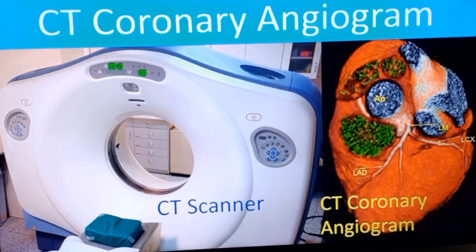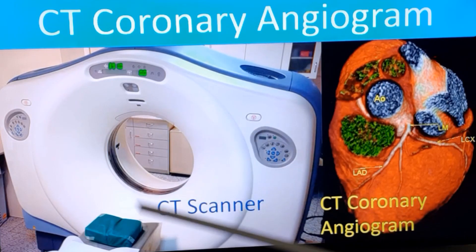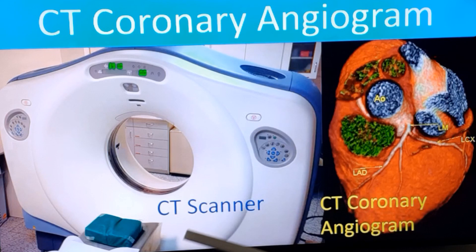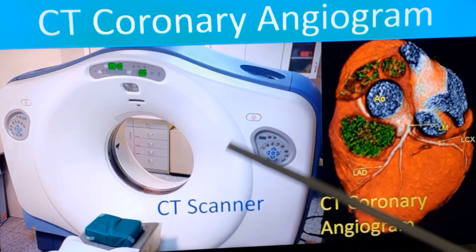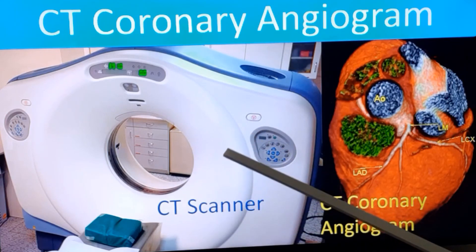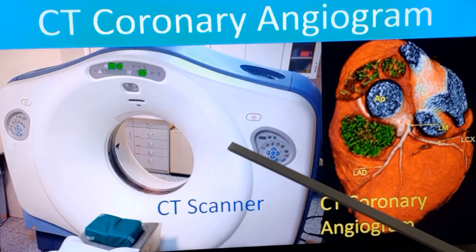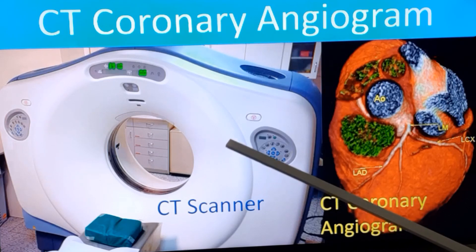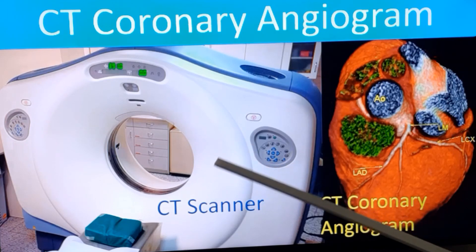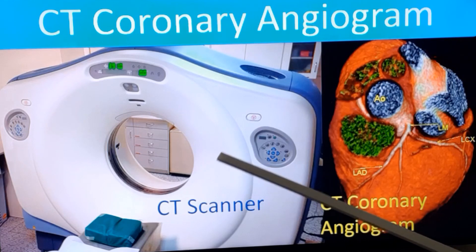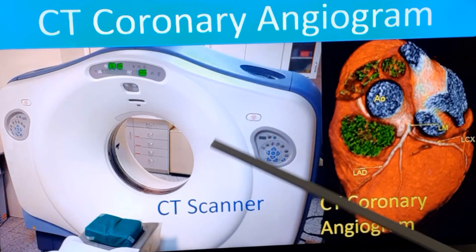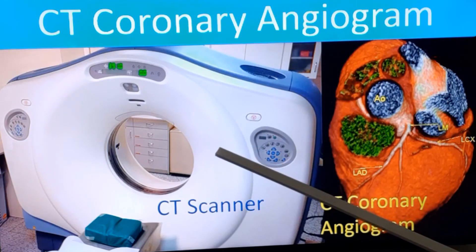Now we will see what a CT coronary angiogram is. CT coronary angiogram is an outpatient procedure done in the CT console. You can see the CT scanner here. The only difference from a usual CT scanner is that it will be more advanced, of a faster speed, and it will have facility for ECG gating. That means the pictures can be acquired timed with the ECG so that it is possible to correlate with the timing of the heart cycle.